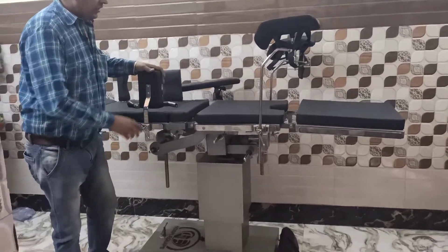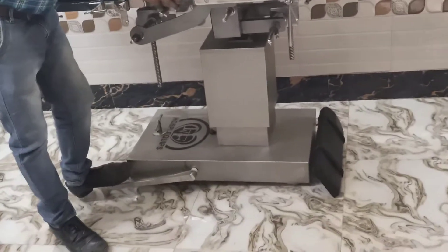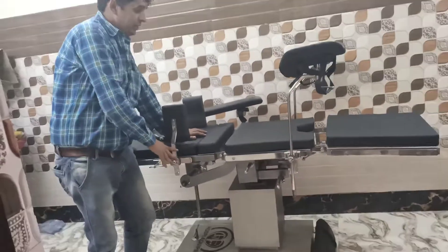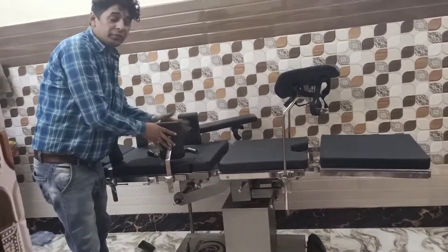This is our stainless steel table with all accessories. Two hip support — very good.